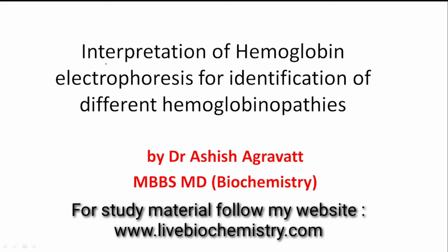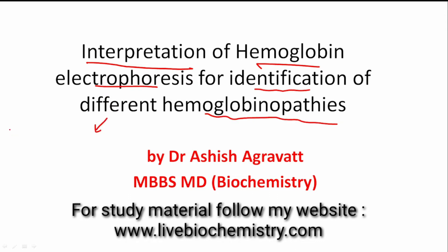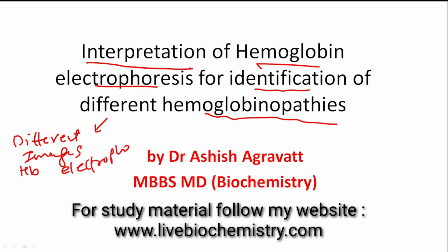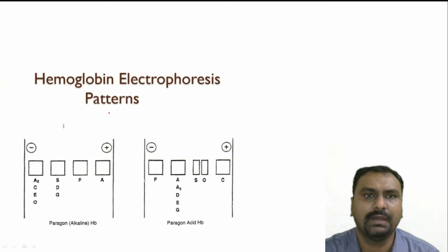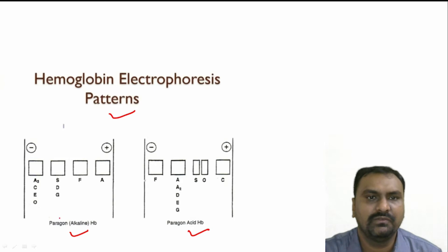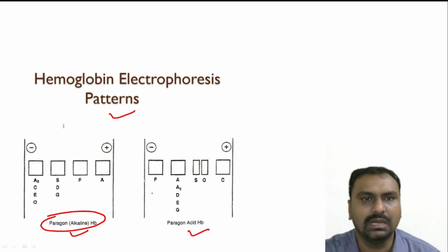Hello all, I am Dr. Ashish Agrawat. In this video, I am going to discuss about the interpretation of hemoglobin electrophoresis for identification of different hemoglobinopathies. We will see different images of hemoglobin electrophoresis on agarose medium, mainly the alkaline pH. We will mainly discuss in this video about the alkaline hemoglobin electrophoresis.